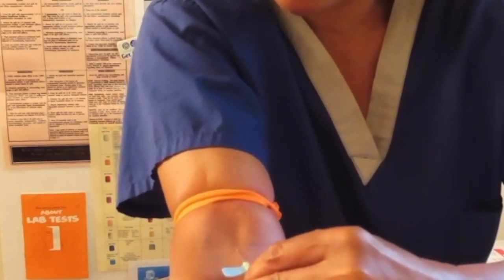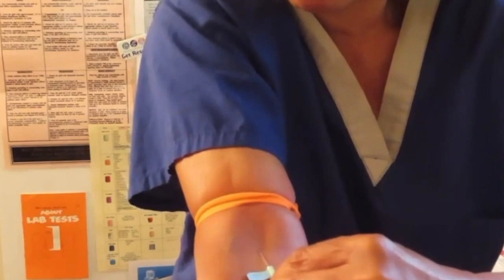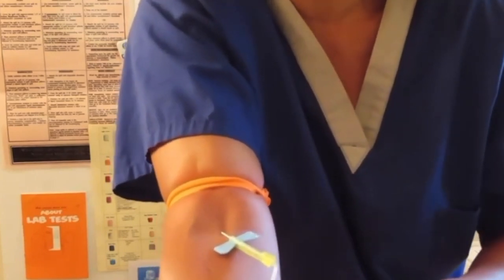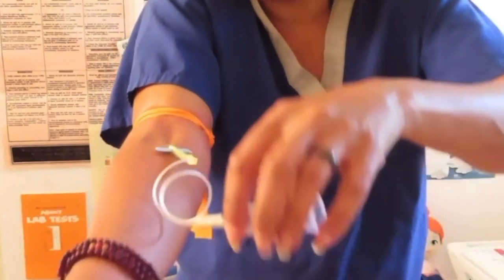But you guys see, I like to lie flat and just go right in. Most times it's a nice little glide. You can feel the puncture, and then of course you always see your flash. See the little darkness there? So that means we hit our vein. So we're going to go ahead and get our tube.